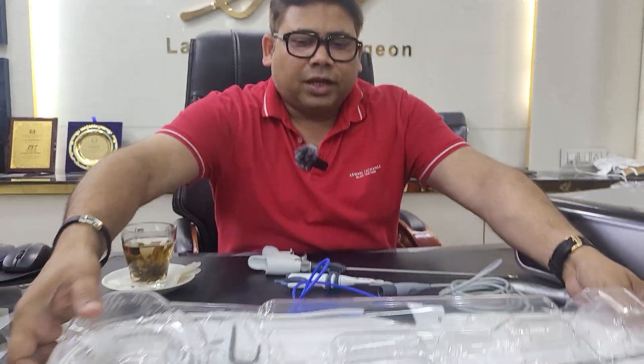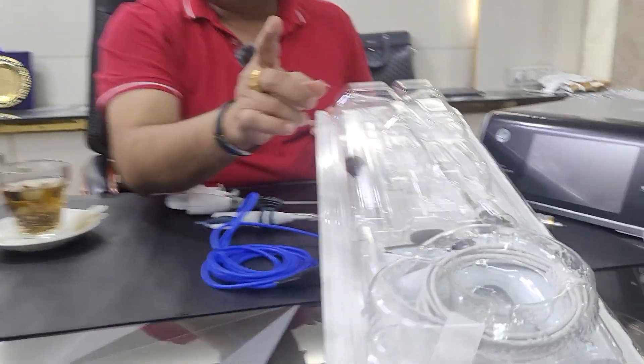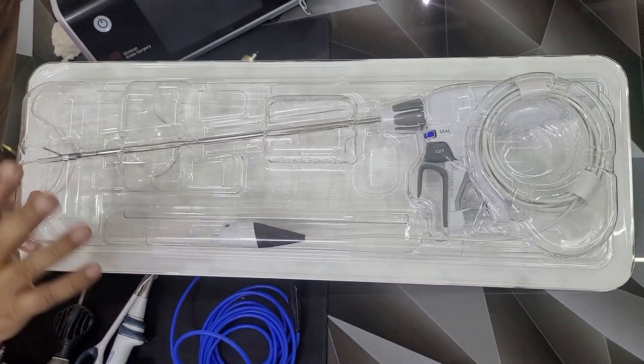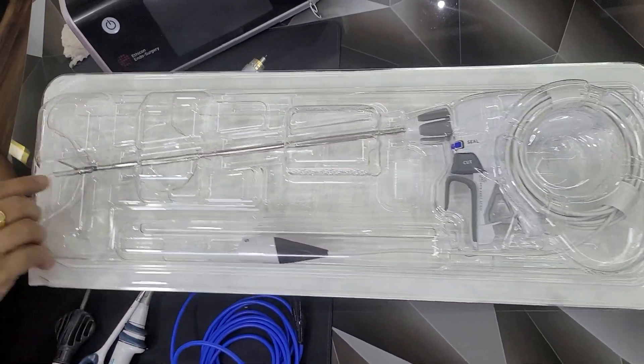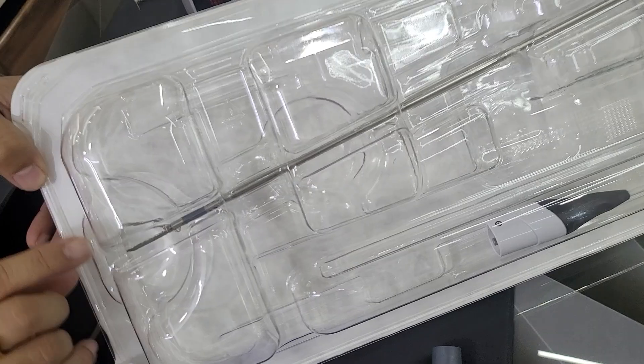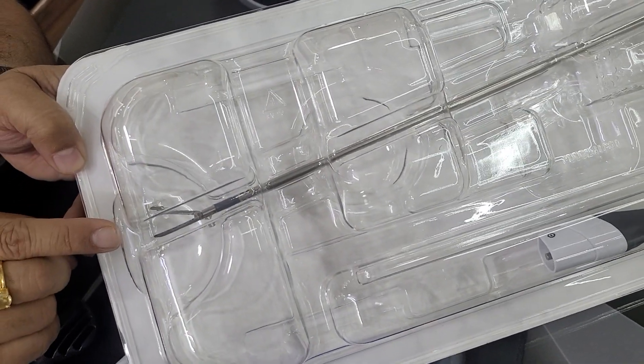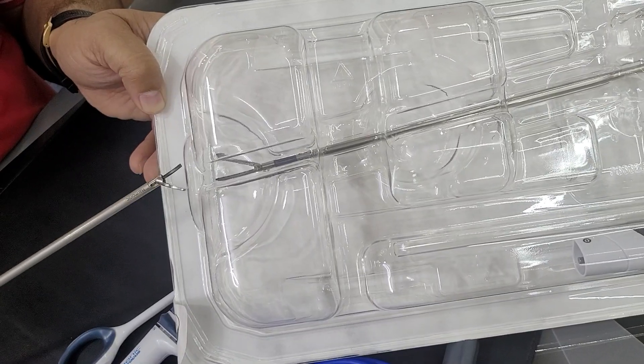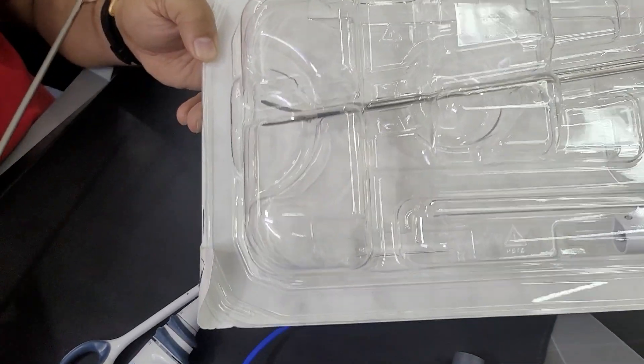Many of you are confused between harmonic and a Ligasure. When we talk about Ligasure — and today I am showing you Enseal, which is from Johnson & Johnson — Ligasure is a smart bipolar. Can you see the jaws? These two jaws are the same, unlike the harmonic where both jaws are different. So this is a smart bipolar.